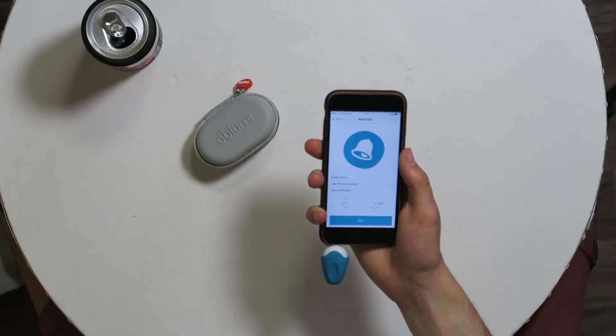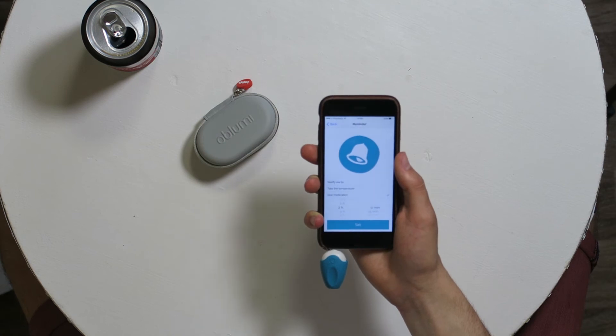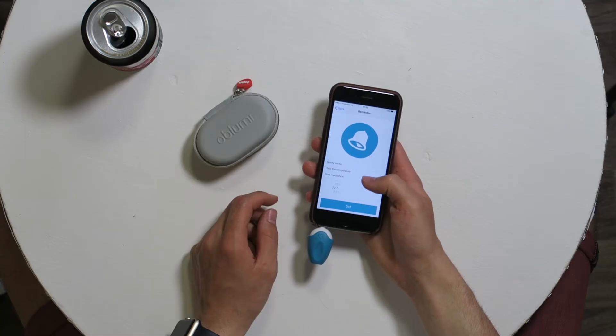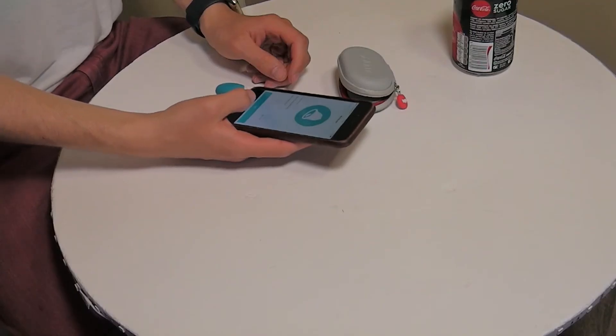It's a lot easier to measure from inside a cup rather than from a can. As an extra feature, you can set an alarm to notify you to take your temperature or give medication. For example, I set it to go to bed at 10:45 and give medication — I'll get a notification at 10:45 reminding me to take my allergy meds.